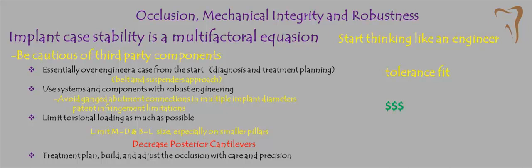There are some factors that you may not be able to judge, and I would say there are issues called patent infringement limitations. If a third party can't engage all the features of an implant that's still on patent, or if an implant connection is off patent and they're duplicated out there, the problems that were potentially with that connection early on will probably be with the duplicated one as well. And then there's also the matter of tolerance fit, which I don't think, generally speaking today, should be a huge issue because of the CNC manufacturing and whatever. But I'd just be cautious, especially when you have small diameters.